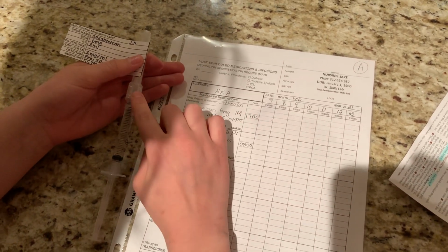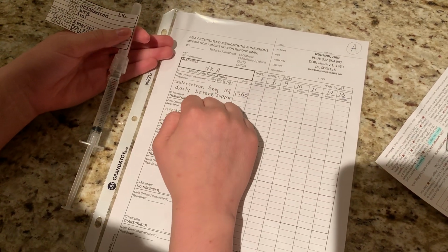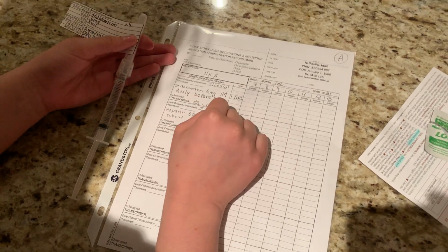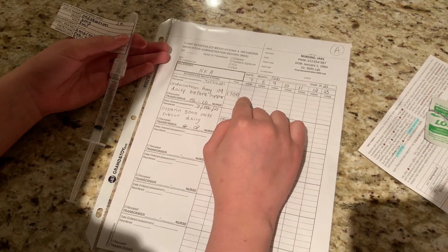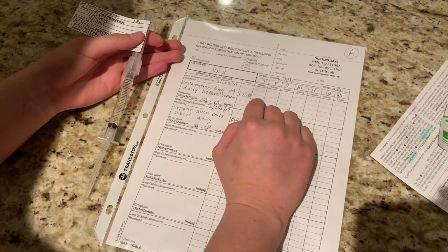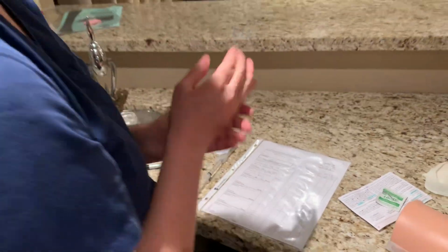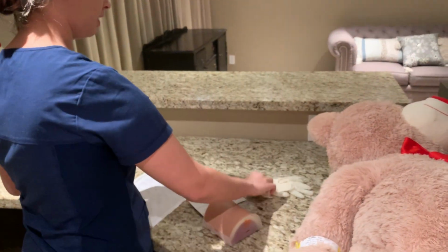I've chosen the right needle and syringe for a ventrogluteal intramuscular injection. Right time and frequency, daily before supper. It's scheduled for 1700. Currently it's 1635, and no one's given this med, so I'm okay to give it. Before I administer, I'm going to do hand hygiene and then put on my gloves.